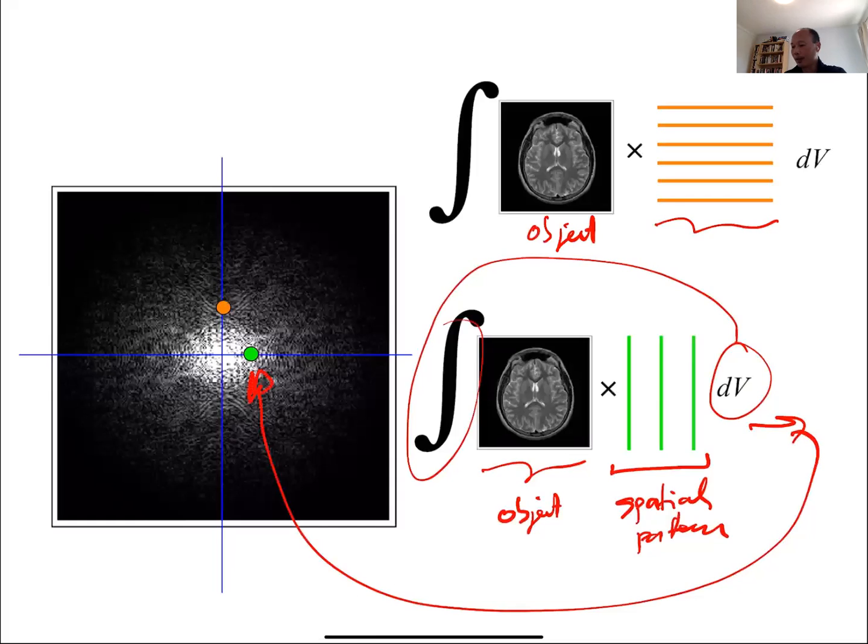And then after you integrate, you plug in the value and you fill in k-space bit by bit by bit. Okay, so in MRI, we're essentially filling in k-space. And then once we have enough information in k-space, we can take the inverse Fourier transform and get back our image or an estimate of our image.